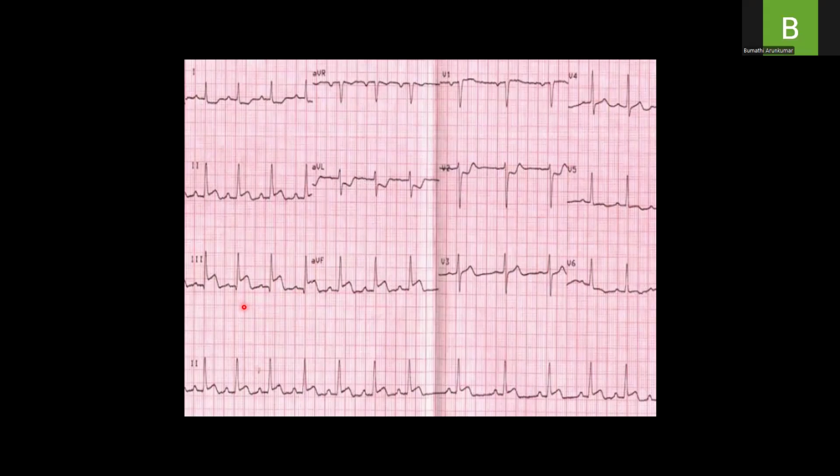Sir, in which leads do we have to see the ST elevation? Leads 2, 3 and AVF. I told you when I was talking about lead orientation, leads 2, 3 and AVF represent the inferior wall.